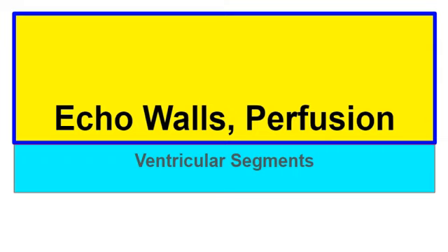So this is our final subject in Unit 1, last week, week 4, and it's going to be about echo walls and the perfusion of those walls of the heart, and in particular ventricular perfusion, ventricular segmental perfusion.